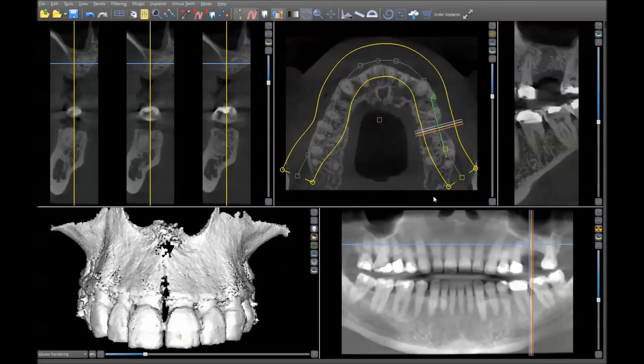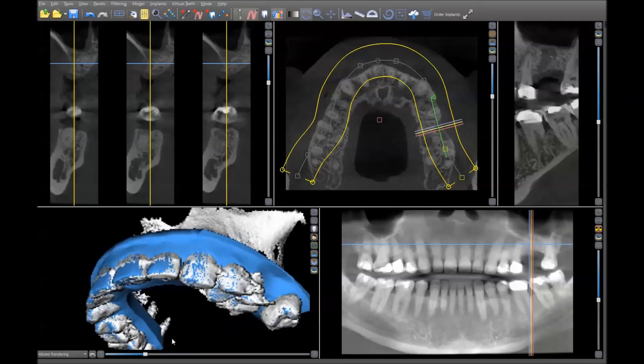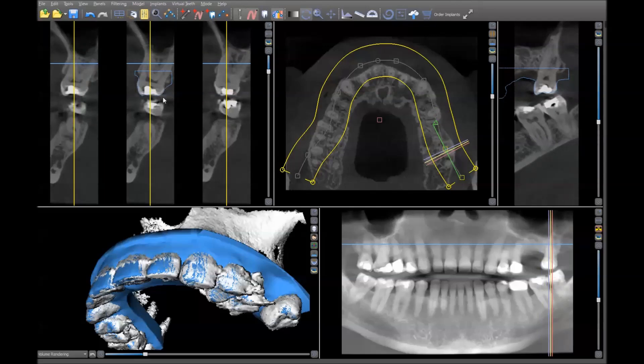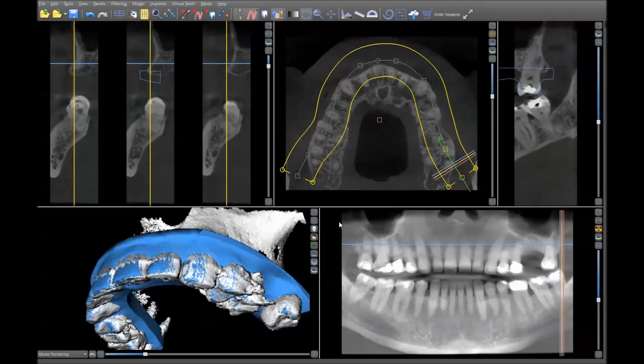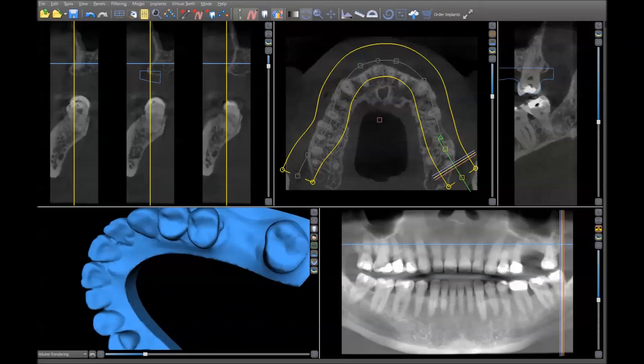Here we have our patient after six months of healing, so now it's time to do the work in the software to create our surgical guide. The way that we do that is we merge an STL model — as you can see, this has been merged very accurately. You can see the outline following closely to the teeth, and once we've done that we can turn off the 3D rendering. Now it's time to plan the implant position.